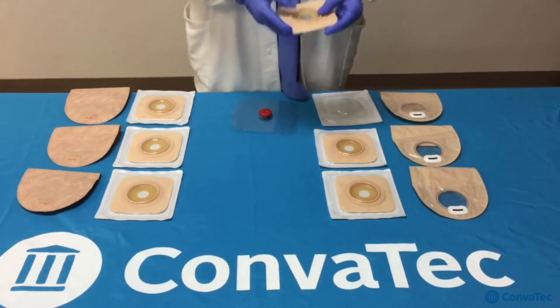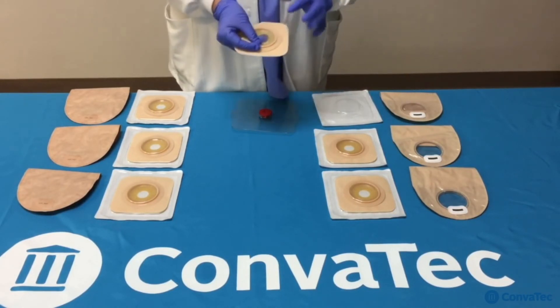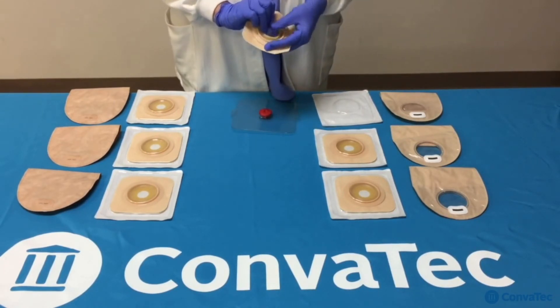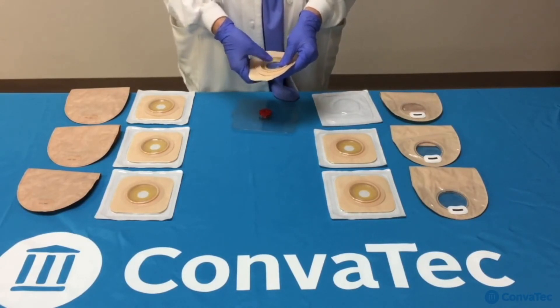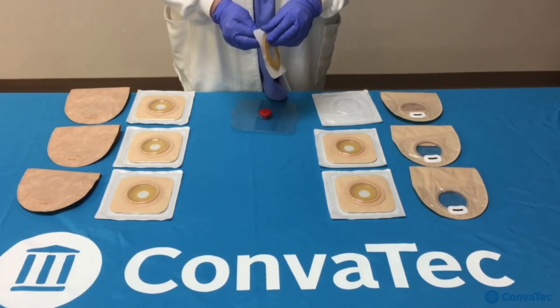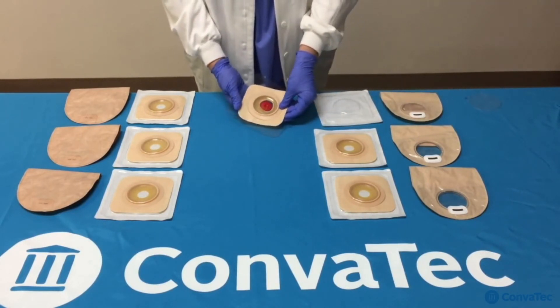Then you would simply use your fingers or thumbs to roll open the skin barrier like this. Don't worry if you roll it open too big, because with the patented memory technology, it will come back and hug the stoma. Once you have rolled it open to the size that you would like, remove the clear backing using the slight blue tab — just peel it off. And then you would place the wafer around your stoma like this.